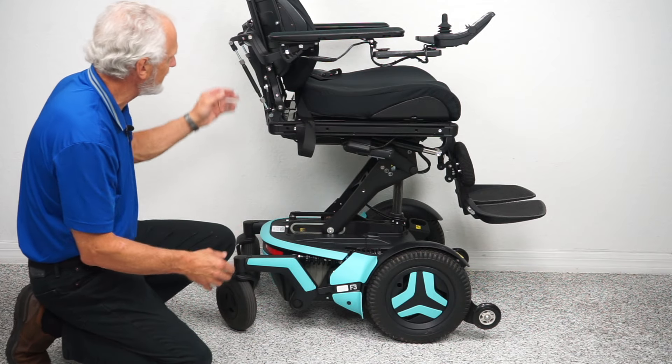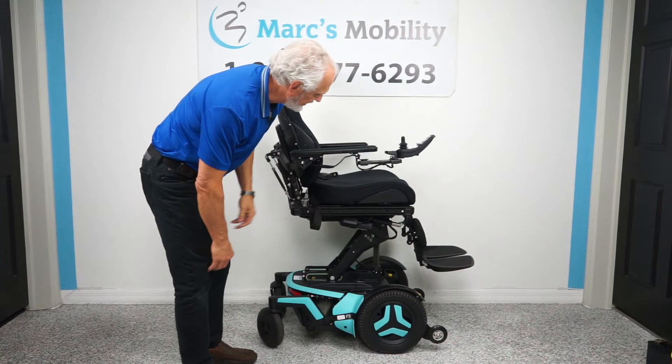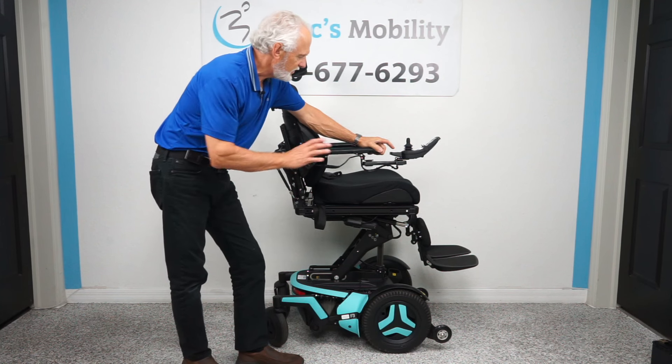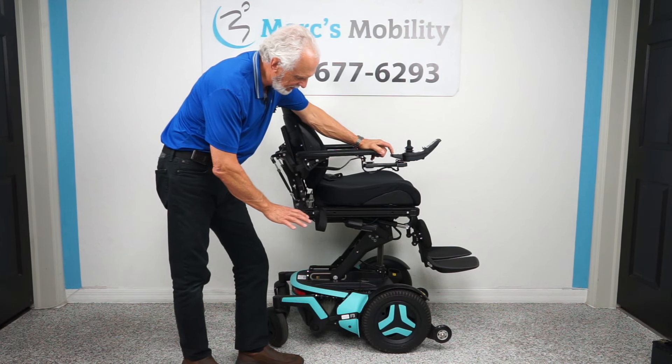You can see the armature here for the seat lift — you can see how well constructed this is. Of course, this is a Permobil — that's the highest quality you can get. This is the top of the line in power chairs. Now I'm going to show you something else that's pretty neat about this chair.